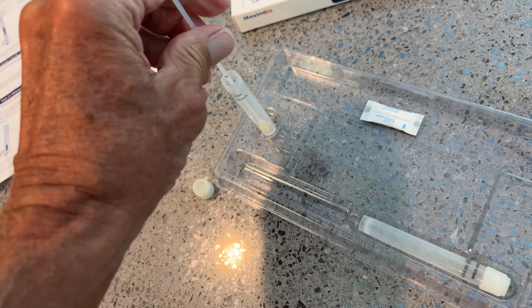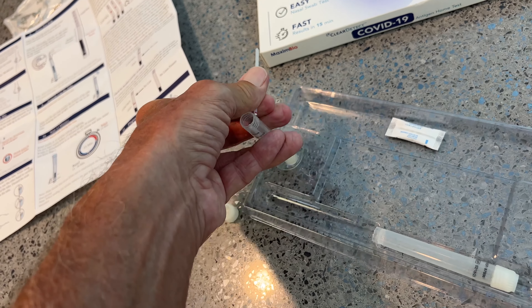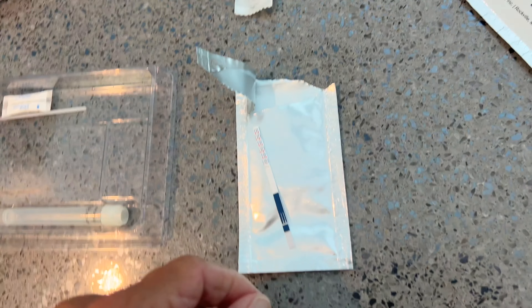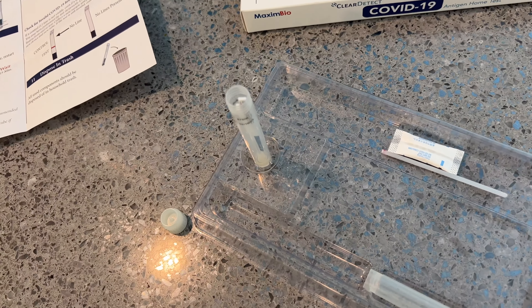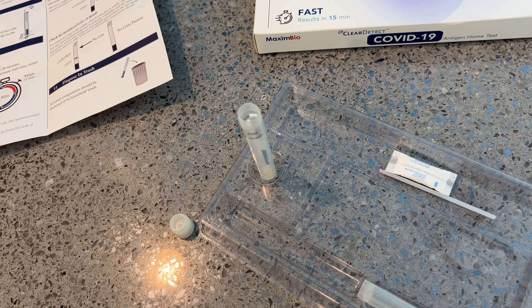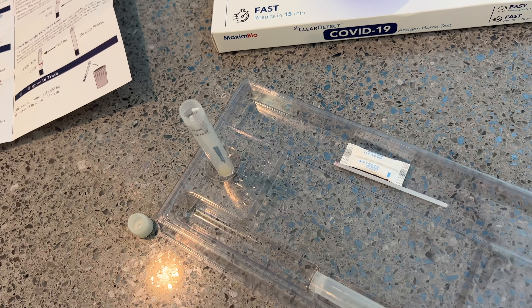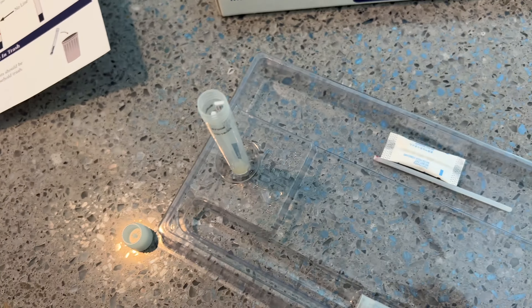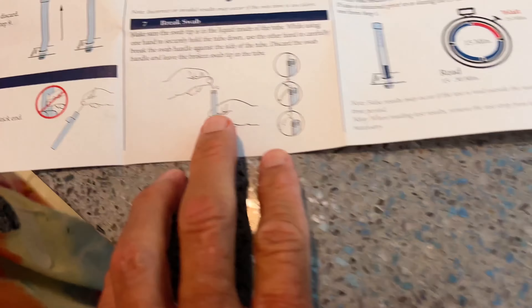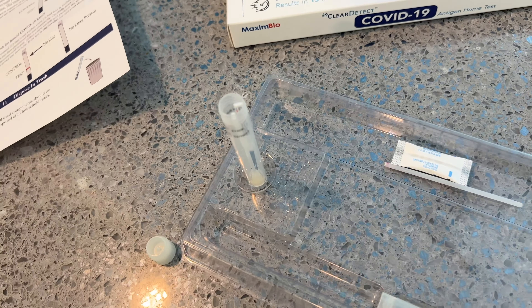I'm just going to keep plunging it, make sure I get 30 seconds in there. All right, then I just got to break it off. Oh, there we go. That was ridiculous. Now I take this side and just drop it in there like that. Now we got to come back in 15 minutes. Oh, did you put it in there already? Yeah, you stick it in — you leave it all in there. Snap it off, stick it in. That's what we did. I think it's kind of stupid now. How do you get it out of there? It's ridiculous.